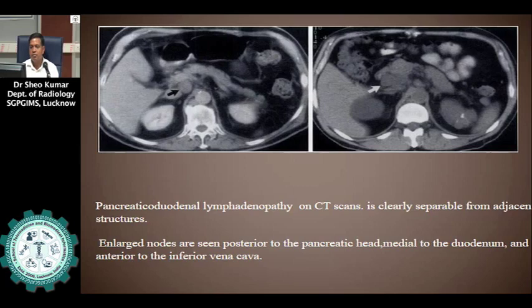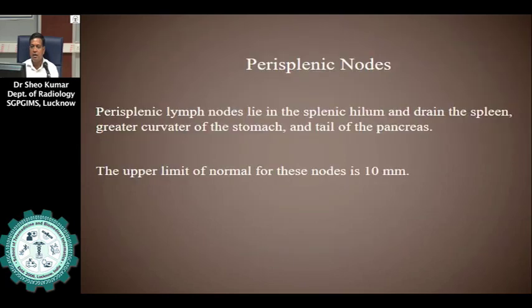Pancreaticoduodenal nodes lie within the duodenal sheet and pancreatic head, anterior to the IVC. Lymphoma, carcinoma of the pancreatic head, colon, stomach, lung, and breast are common malignant processes to involve these pancreaticoduodenal lymph nodes. CT scan images show a lymph node on the right side, and on the left side multiple lymph nodes clearly separated from the IVC and aorta.